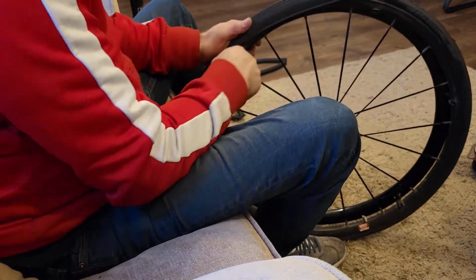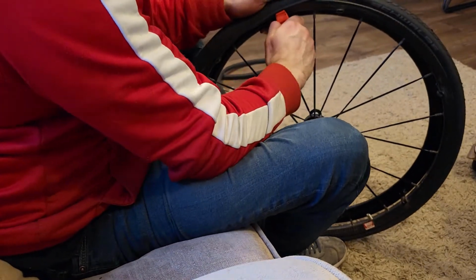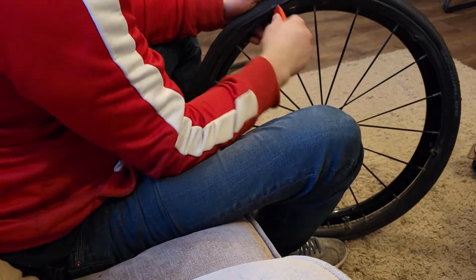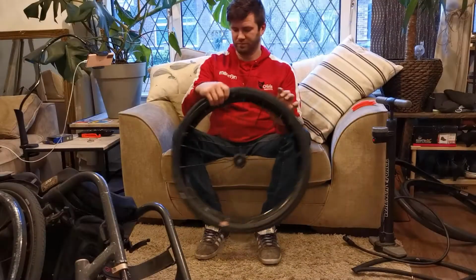Now you've got to be really careful here not to nick the inner tube inside. The last thing you want to do is end up puncturing a brand new inner tube. And again, that's why these new tyre levers have proved really good. They've got a big sort of flat head on them, and they managed to stay away from the inner tube, pushing it out of the way.